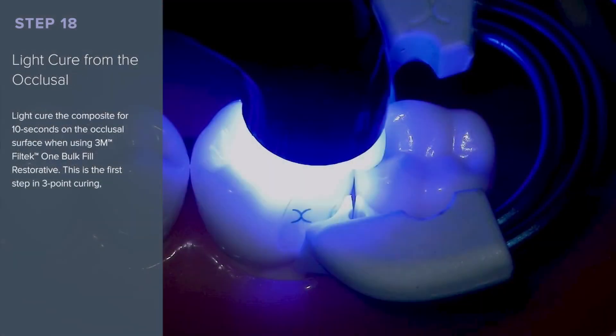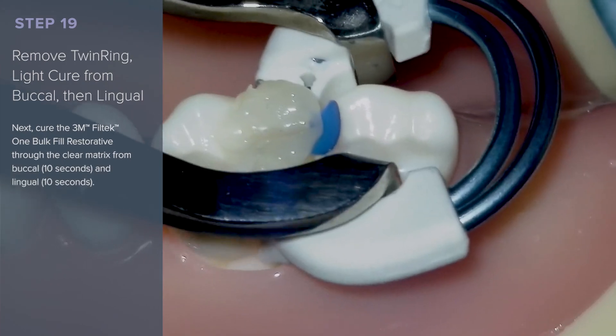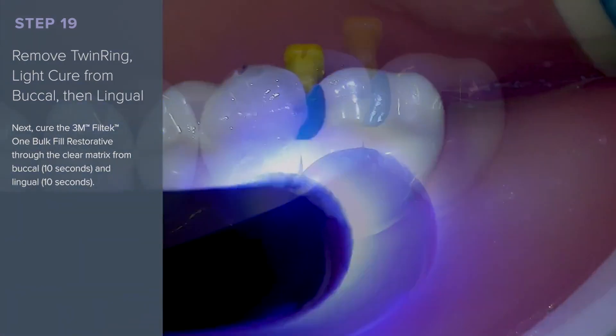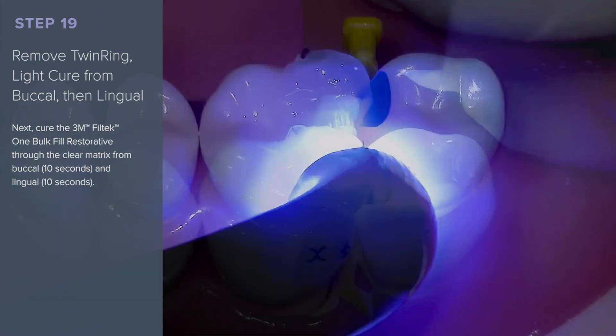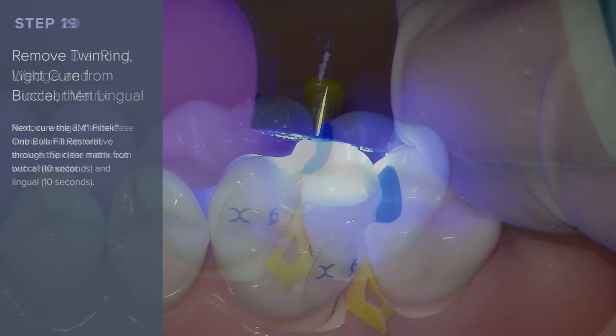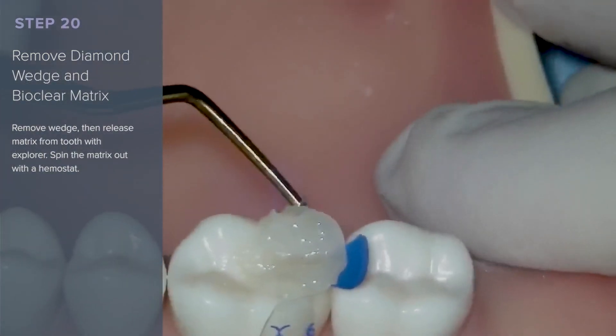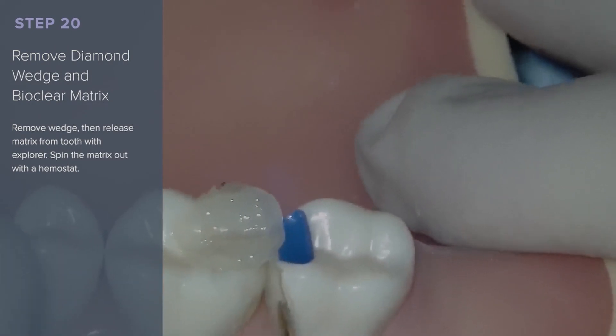Light cure the composite for 10 seconds on the occlusal surface — this is the first step in 3-point curing. Remove the twin ring and then light cure from the buccal and the lingual for 10 seconds each. Remove the diamond wedge, then release the matrix from the tooth with an explorer. Spin the matrix out with the hemostat.